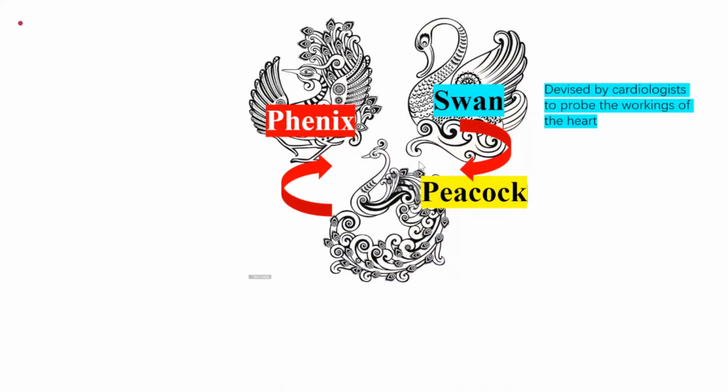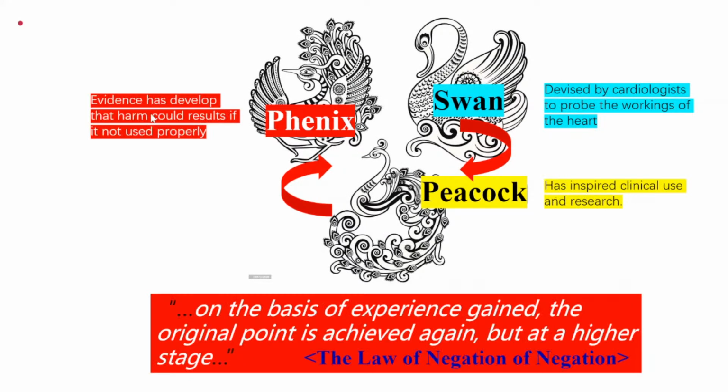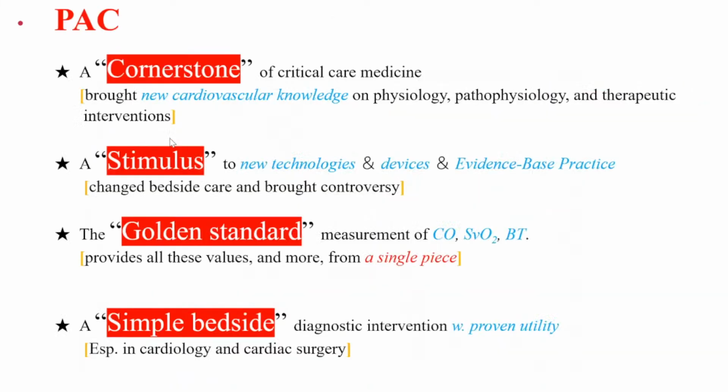PAC is a cornerstone of critical care medicine. It brought new knowledge. It is a stimulus to new technology, devices, and evidence-based medicine. It remains a gold standard measurement for cardiac output, SvO2, and blood temperature. Don't forget, it provides these data in one piece. PAC is also a very simple bedside tool with proven utility.